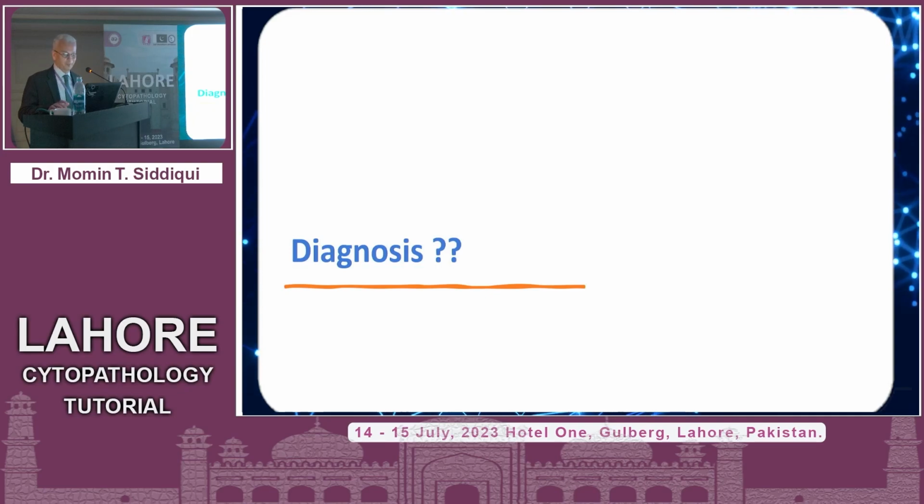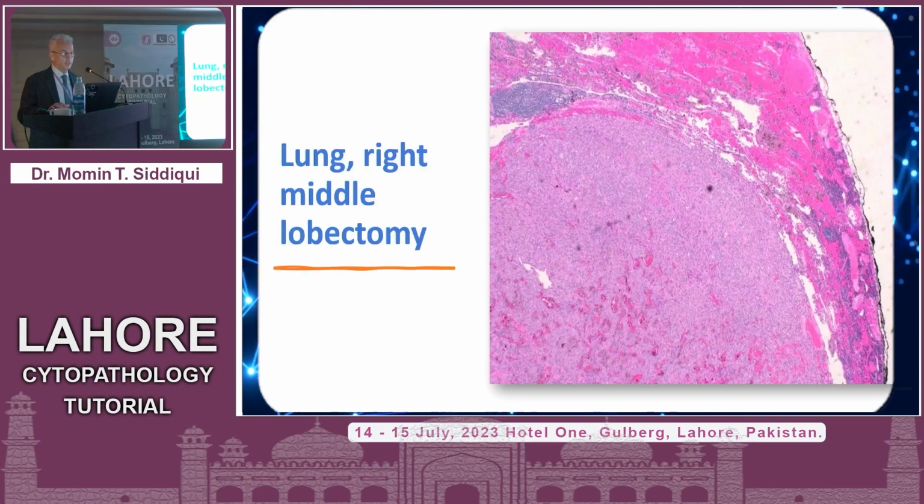Wow, awesome. Okay. So this was a case in real time that was called out as an adenocarcinoma. Not by my practice, it came to us as a consultation case. But the reason for that was that the patient was not convinced. This lady actually sent this case over and we basically resected it. We reviewed the cytology and we disagreed with the primary, just like yourselves.